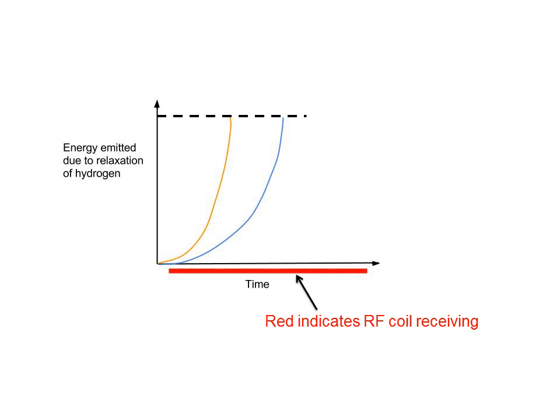But with the RF coil on and receiving for all this time, what will happen is that we'll just recover all of the energy that we put in for both tissue types. So the actual measurement will be the same for both of them. This is illustrated by the dotted line that I've drawn across here to meet the y-axis. The actual value of current in the coil would be the same. We would have lost the information that it took longer for one tissue type than the other, because that's not recorded, it's just the total current in the coil.